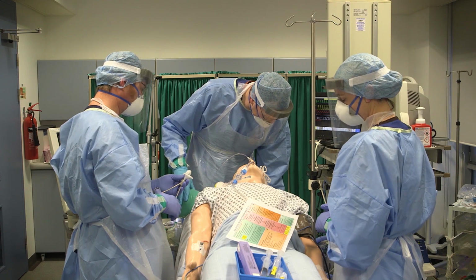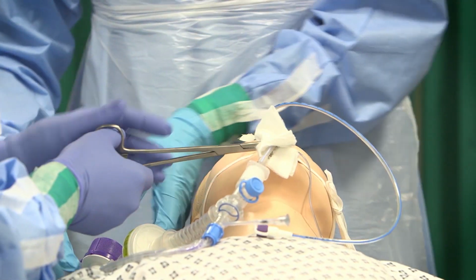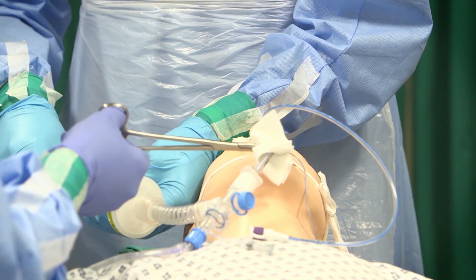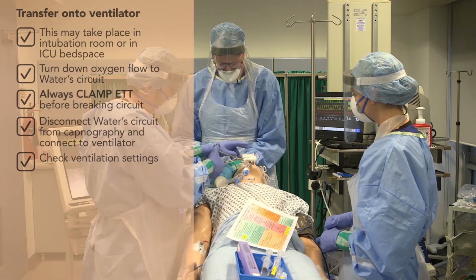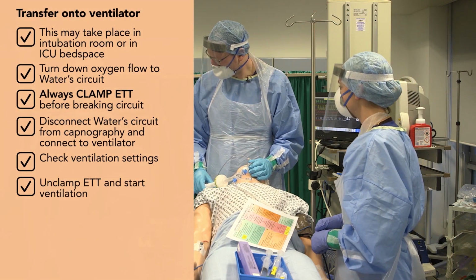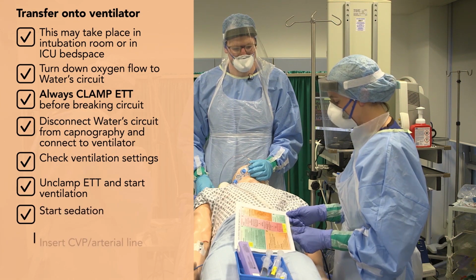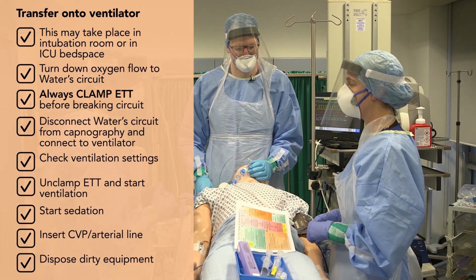So water oxygen's down. ET clamp. Okay, we've disconnected. Connected to the ventilator. If you could unclamp the tube and start the ventilator. Okay, and we are ventilating the patient. So we'll start some sedation, insert a central line and an arterial line, and then dispose of any dirty equipment.